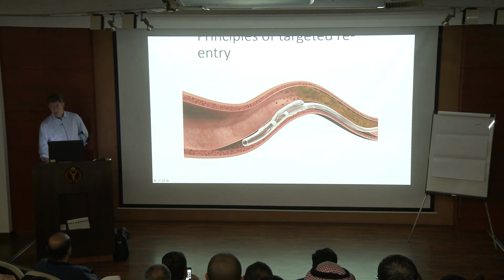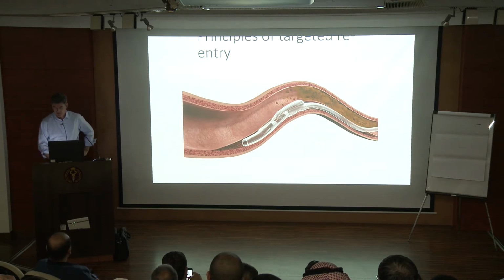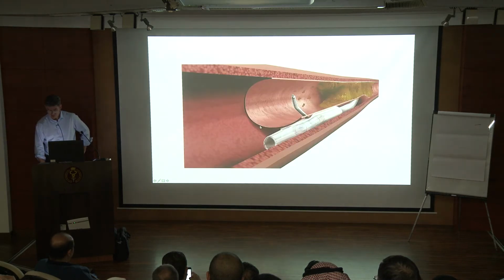Remember yesterday, we didn't use a crossboss catheter at all. We were there alongside the distal vessel, having got there with a gladius wire, and we were able to position the Stingray. We used a Miracle 12 as a stabilizing wire to deliver the Stingray balloon. Once the Stingray was in position, we were then able to puncture back in. And you could see the separation between the wire and the Stingray balloon.